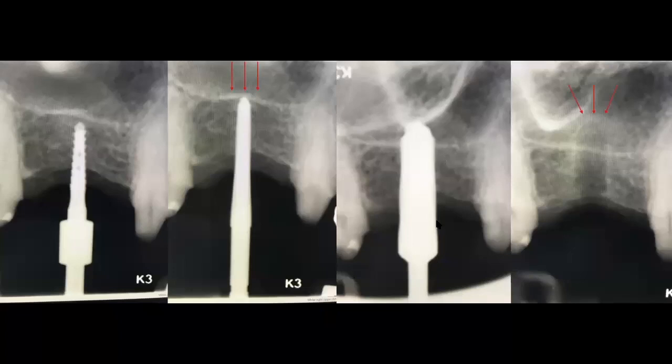And now you can see that I've been able to push bone within the sinus. And you can see that bone, you can see that new cortical, the way that I pushed this to create this shape for my implant. And you can see the actual bone that I was able to push from the sides, from this same side. This is autogenous bone that is being pushed apically within the sinus to cover the implant in that side.